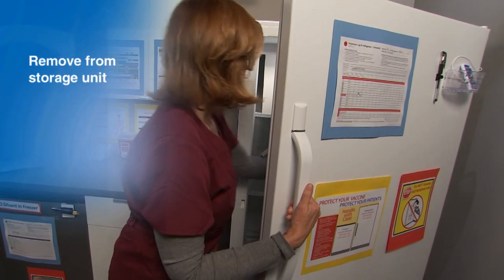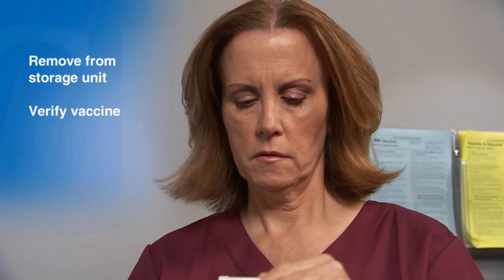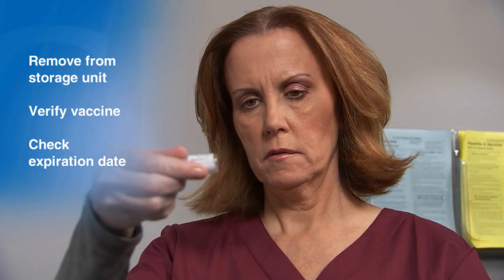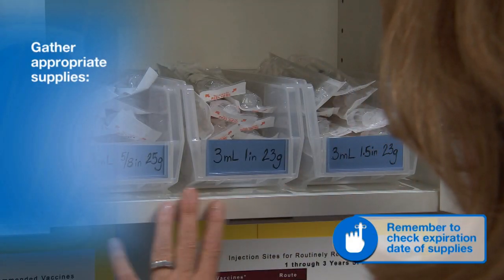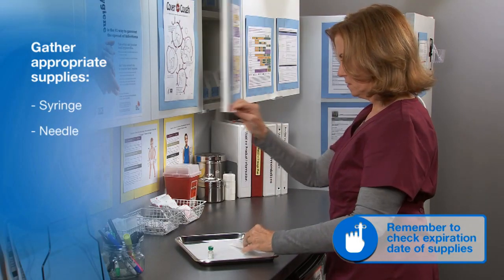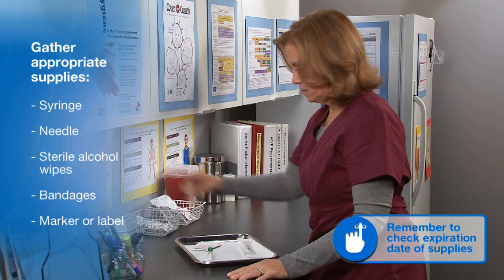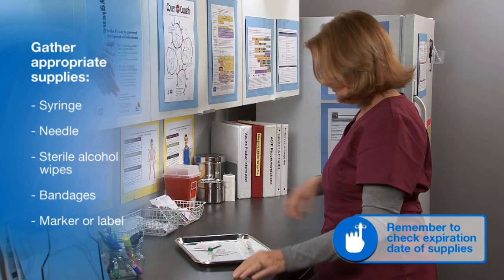Begin by removing the vaccine from the storage unit. Verify you are removing the correct vaccine from the box and check the expiration date on the vial. Next, gather the appropriate supplies including syringe, needle, sterile alcohol wipes, and bandages. A marker or label will be needed to identify the vaccine once it is in the syringe.